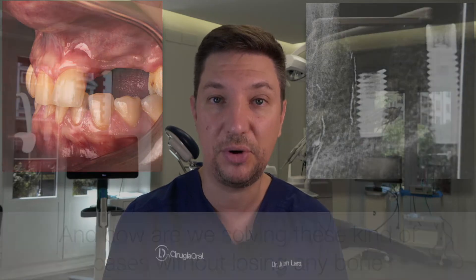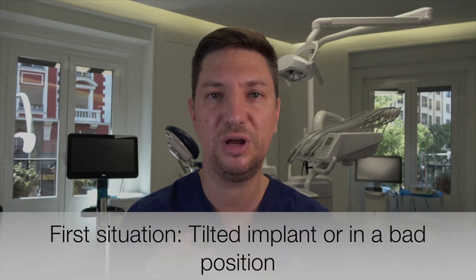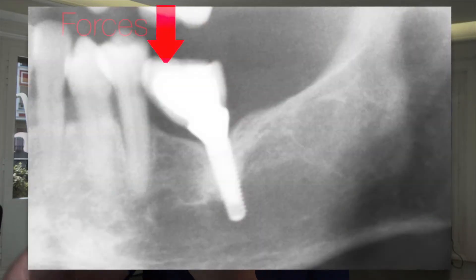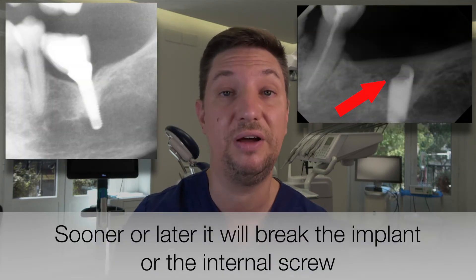Why can an implant break? An implant can break because of an excess of forces in the connection. The first situation is when we have a tilted implant. Implants should be straight and axial to the forces — they shouldn't be tilted. If we have a tilted implant, the forces are going to hit on one side and we can have overload in the connection. When we have an overload, it starts making little fractures, and then we will have a fracture of the implant — a huge problem.